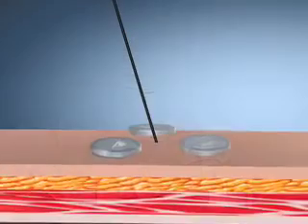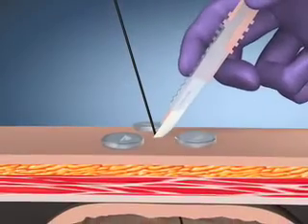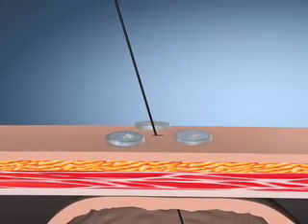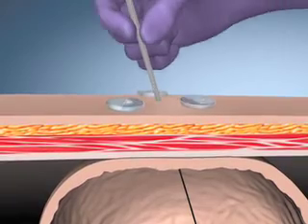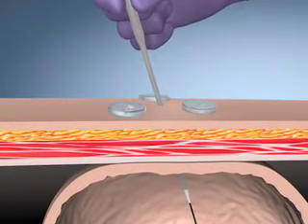Use the number 11 safety scalpel blade to create a small skin incision that extends alongside the guide wire, downward through the subcutaneous tissue in the fascia of the abdominal musculature. Apply water-soluble lubricant at the incision site. Advance the serial dilator over the guide wire.